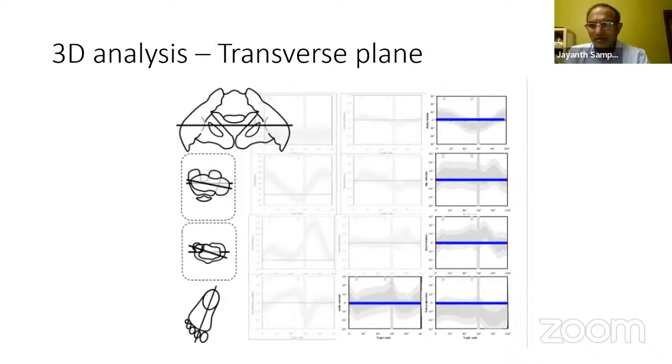Absolutely. For those who don't have a gait lab, just marking the knee with a circle, putting two bright spots on both ASISs, and also making a vertical line on the heel, or looking at the posterior coronal video, really makes a huge difference to appreciating some of the finer details if one does not have a gait lab.